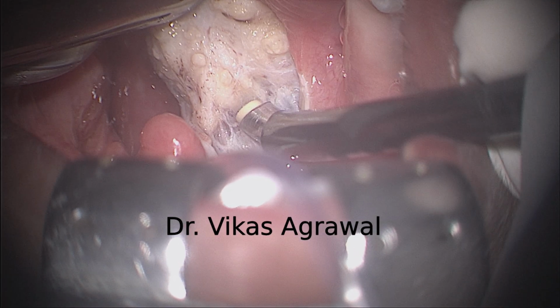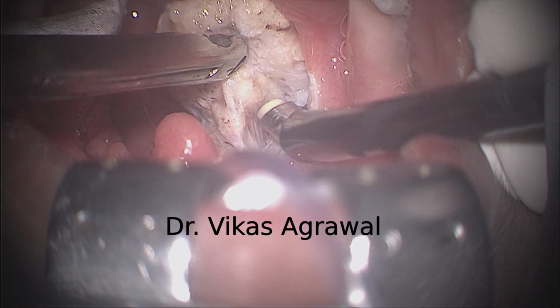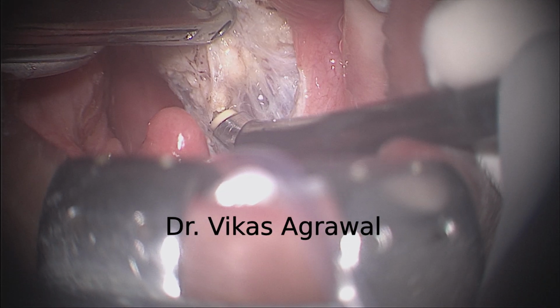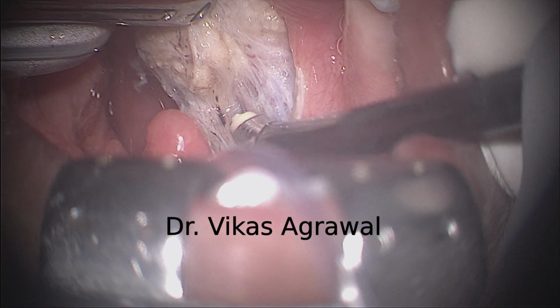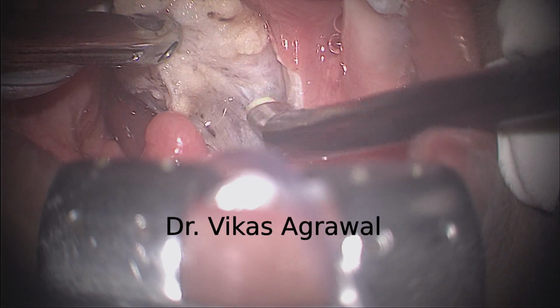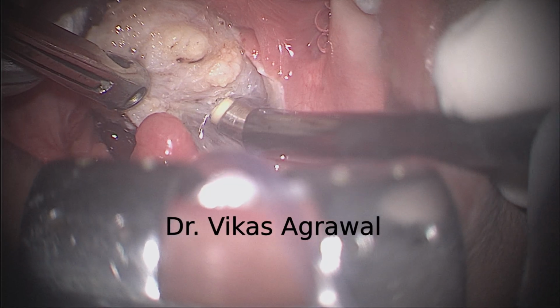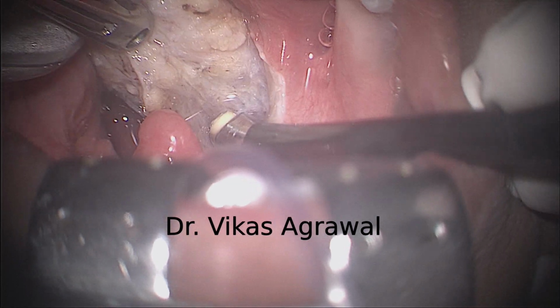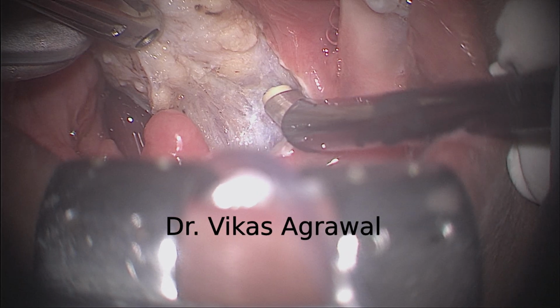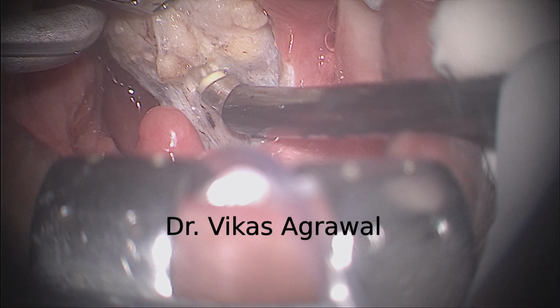Now as we proceed, we might have to open up certain planes where the muscle will be exposed. In extracapsular surgery, at times you cannot avoid exposure of the muscles. That becomes a little painful. Till now, we have been successful in not opening up the muscle plane. But obviously, it's not possible in the entire extent, because as you can see here, some amount of muscle is exposed. Can you see this? There's a difference between this and this. So we have to minimize the exposure of the muscles.